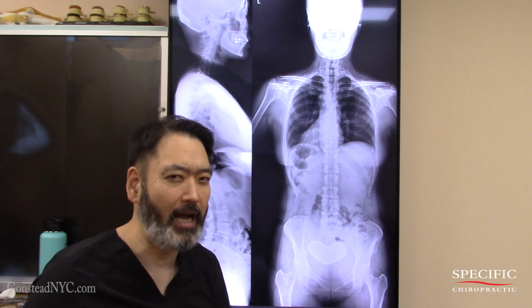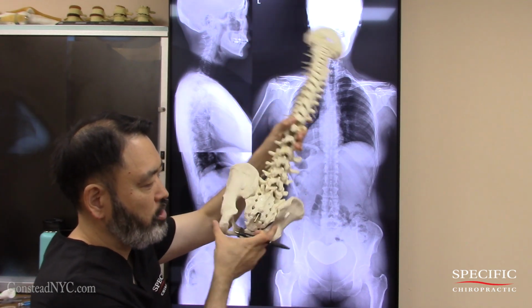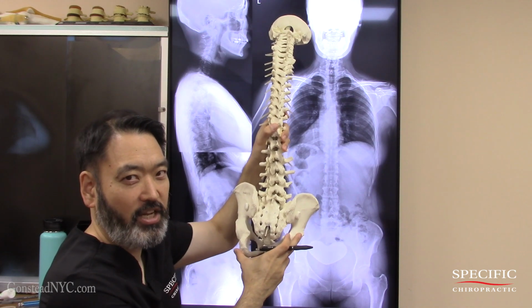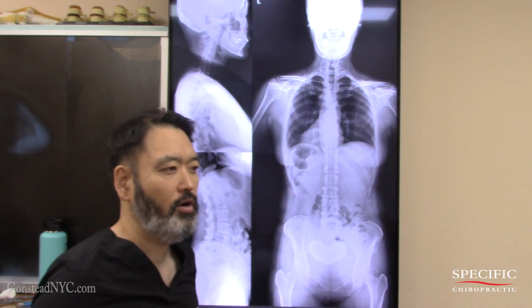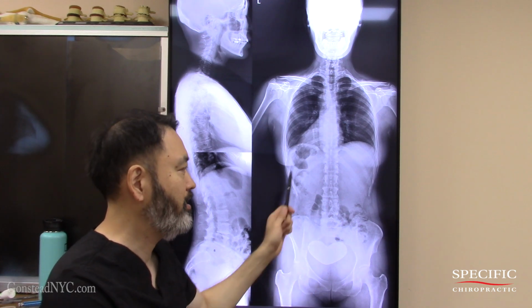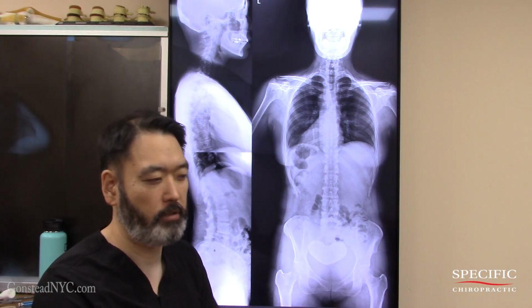Now, during the gait analysis, I was already starting to see that the way she was walking is that she was walking like this way, sinking down on the right-hand side. Now, if we adjusted that right AS ilium, it'll go even more so this way. We also did a Gonstead seated examination and also Derifield, and we did confirm on the patient the right ilium is actually the one that's in trouble and it needs to be adjusted.